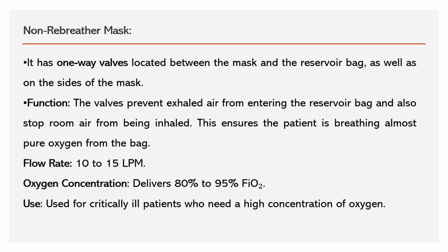Now we are going to learn about the non-rebreathe mask. What's non? It has a one-way valve. It is located between the mask and the reservoir bag, as well as on the sides of the mask. The function of the valve is to prevent the exhaled air from entering the reservoir bag and also stop the room air from being inhaled.